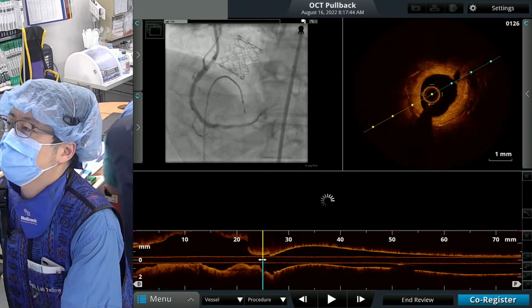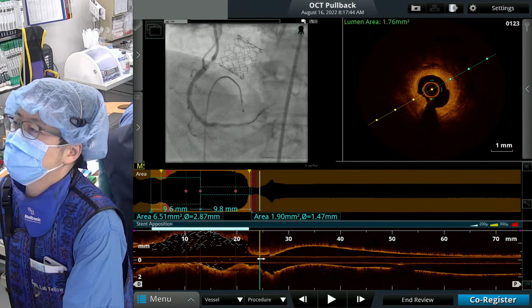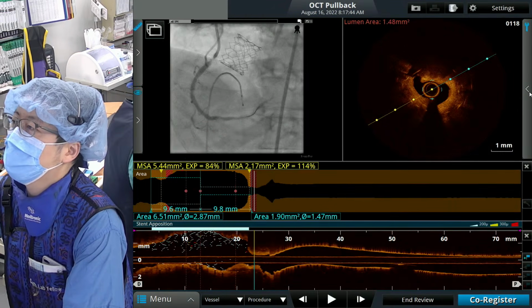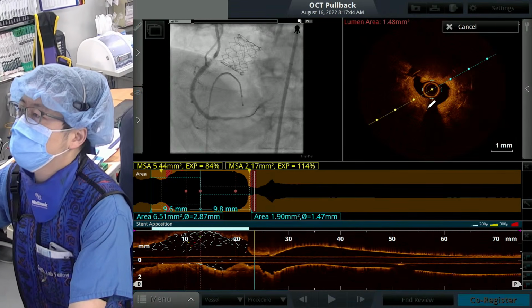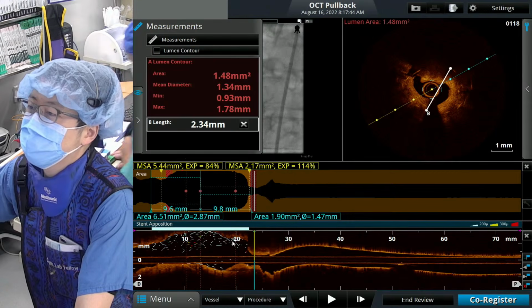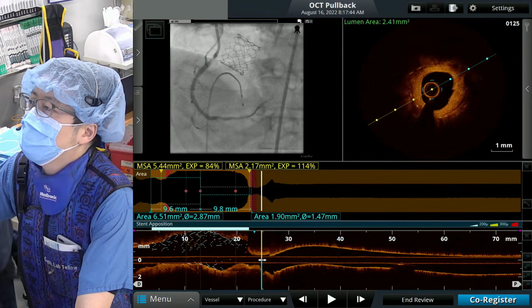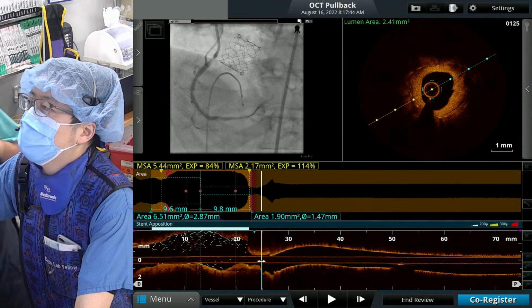Go to this. So yeah, this is just the ostial RCA stent, with concentric neointima. Everything is good. Go to the stent size. Give me the follow-up, 20 minutes. Yeah, it's expanded, beautiful. 2.3 or something. Beautiful. Do you see calcium outside? We'll give some medicine.